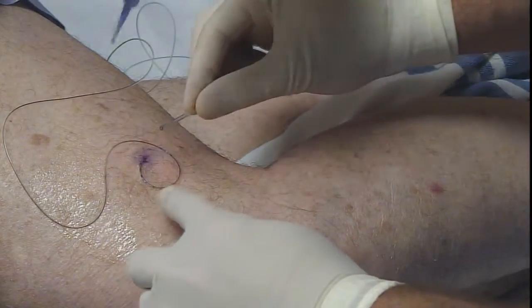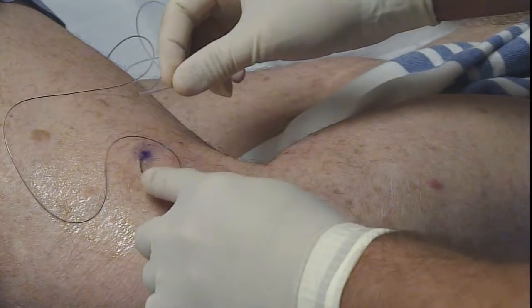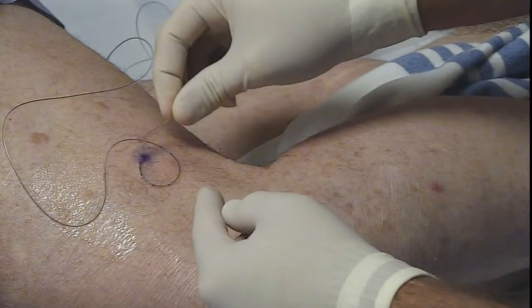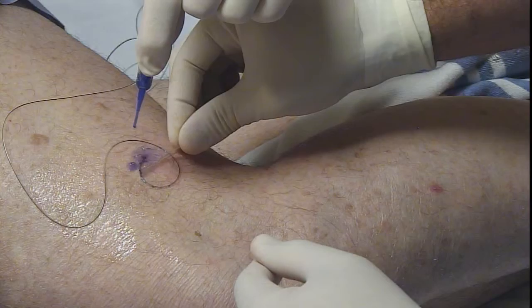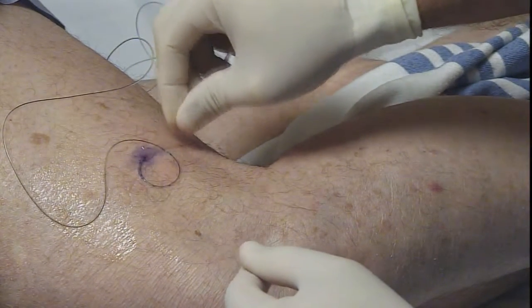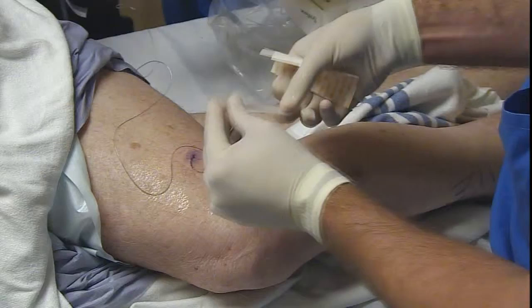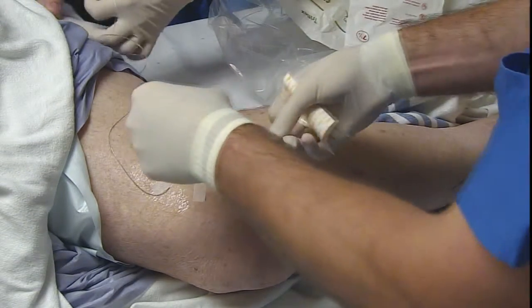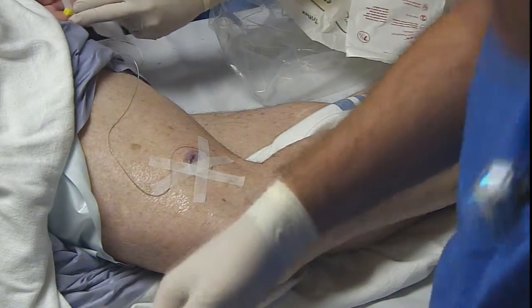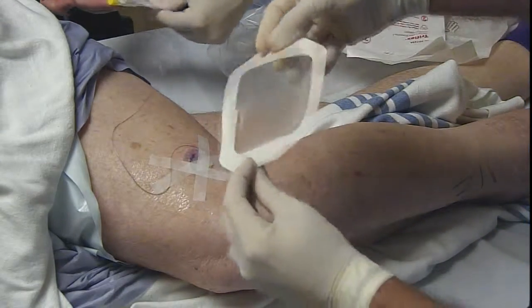Todd, with a sterile glove, is allowing a histoacryl drop to free fall onto the insertion site. Since it doesn't start off as viscous as it ends, in case some of the drop starts to fall away from the intended target — the hole in the skin — I can use the wand to spread it around. For this one I'll do about four drops. This site tends to leak the most in my practice, so I make sure the hole is nicely sealed with about four drops. We're going to do a little star pattern of sterile strip placement, then throw the Tegaderm on.